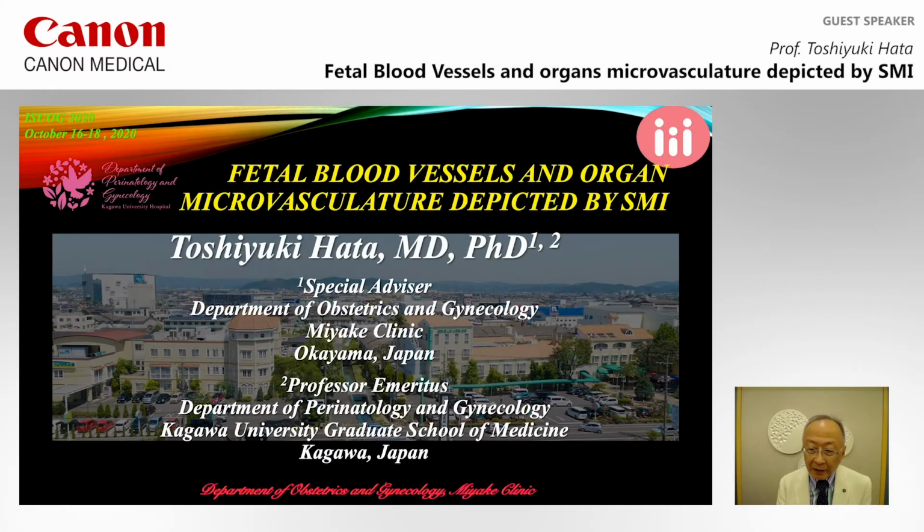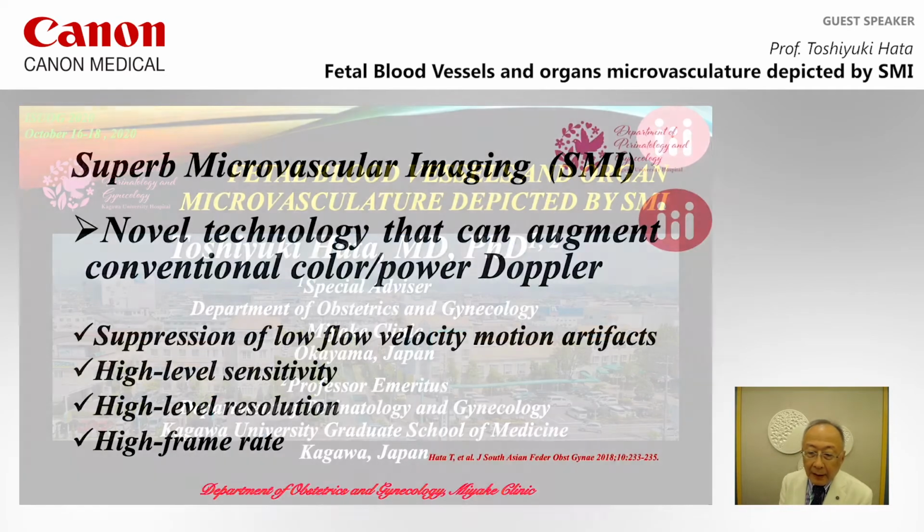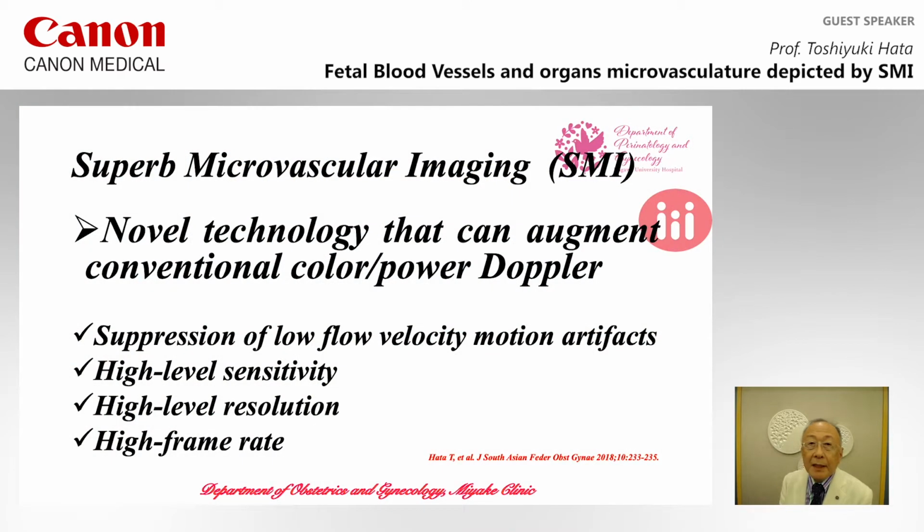Gentlemen, my talk today is fetal blood vessels and organ microvasculature depicted by SMI. I would like to introduce superb microvascular imaging, SMI. SMI is a novel technology that can augment conventional color power Doppler.